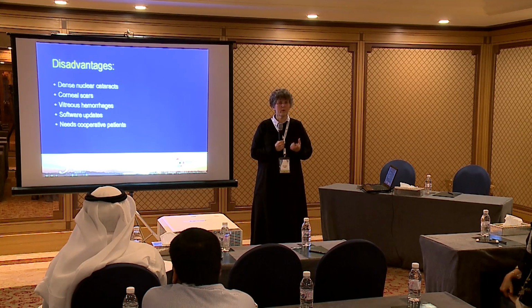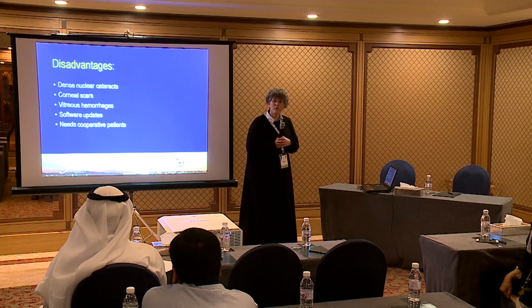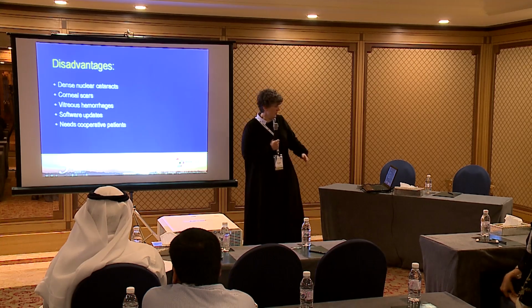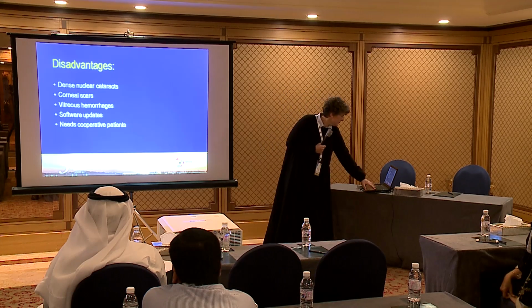So the people who write the formulas write new algorithms that get down into the software, and we need the people to get us the new software. And we need cooperative patients. Patients who can't sit up or who can't fixate or are otherwise debilitated can't do this, okay?